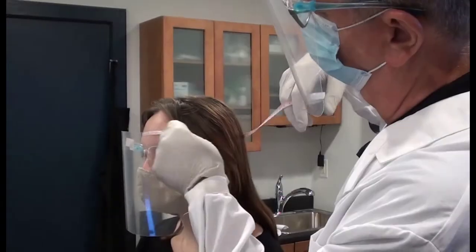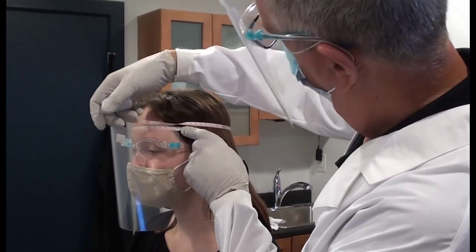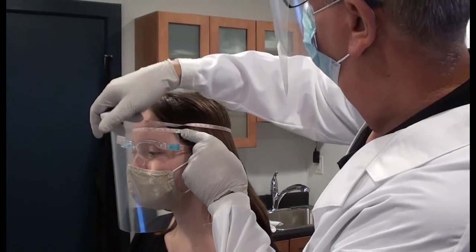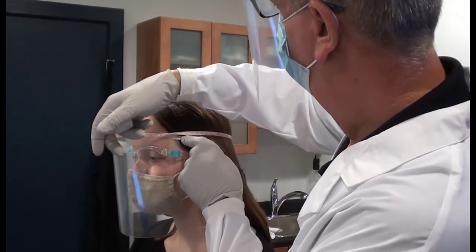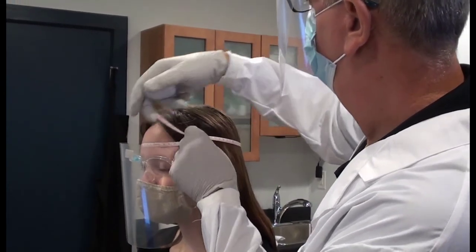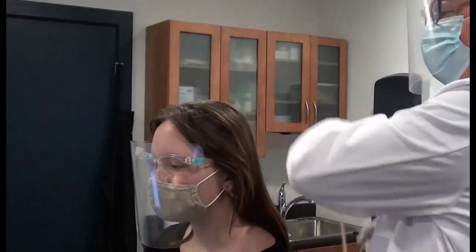Long hair should be spread out evenly on the sides and back of the head. Thick or curly hair that cannot easily be spread out should be compressed when you measure the head so that the size of the cap you use is based on the size of the head, rather than the amount of hair.